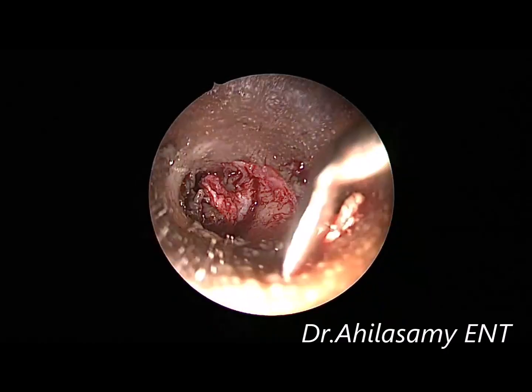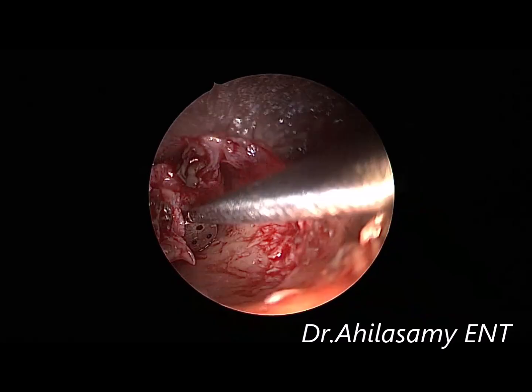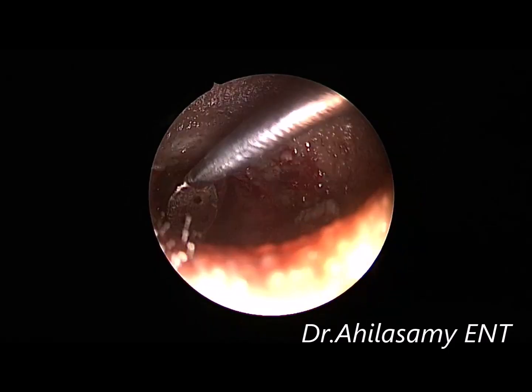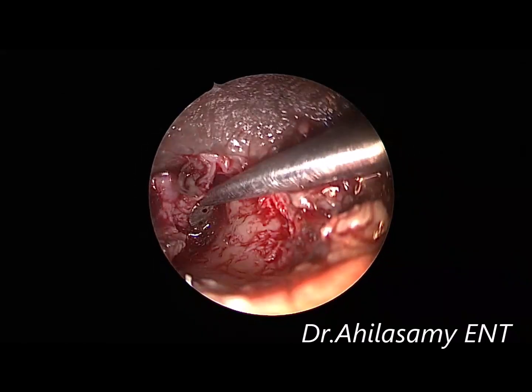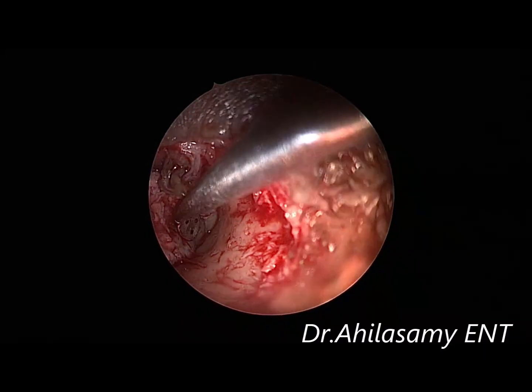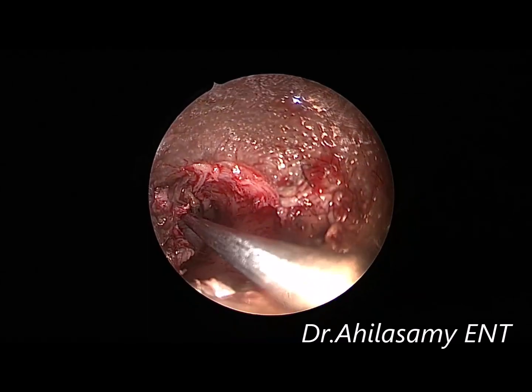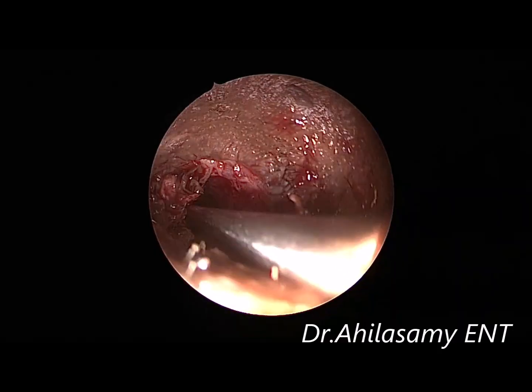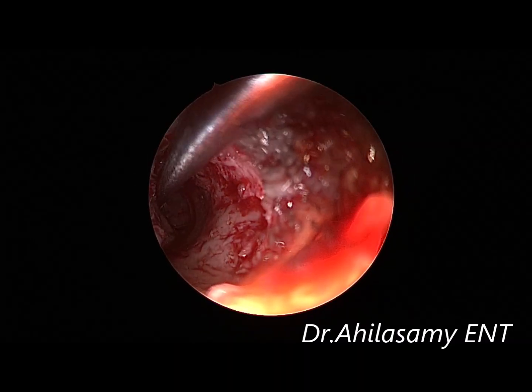Now the tympanomeatal flap is almost cleanly elevated. Now I am going to enter the middle ear space by lifting the annulus. I am lifting the annulus and entering the middle ear space. Now I am using a cotton ball for easy elevation.